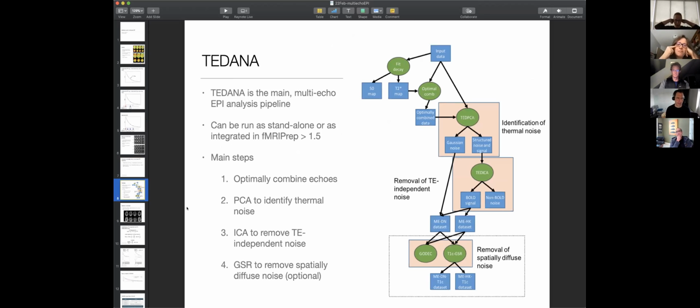So in terms of processing multi-echo data, there is currently one main pipeline called Tedana. It is a BIDS pipeline, although Ravi just pointed out that there's a group that is slowly developing a toolbox called fMRwhy, and there's a link at the end of the presentation, that is looking to be an SPM12 MATLAB based toolbox, that they will be reprogramming the main parts of Tedana for MATLAB based analyses. I took a look at the toolbox. They don't have the multi-echo code yet. But it's sort of on their to-do list and main feature list.